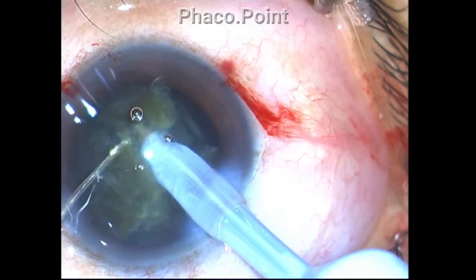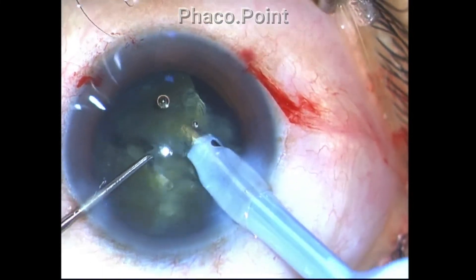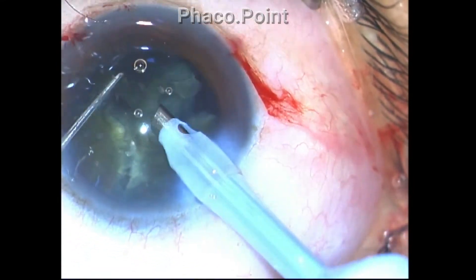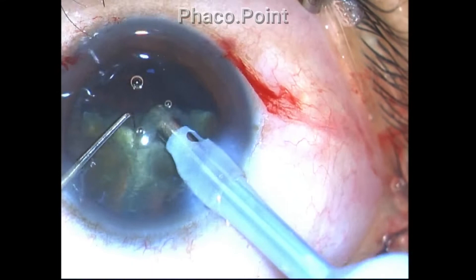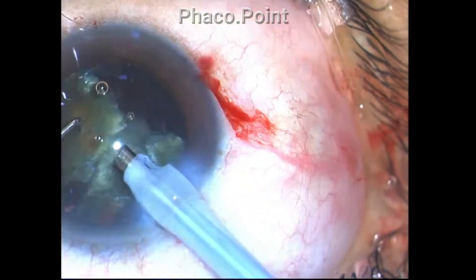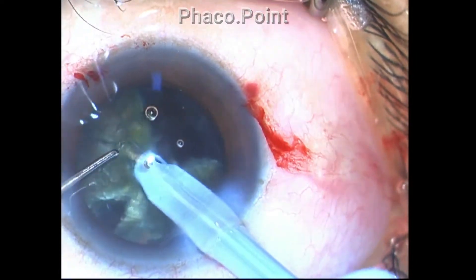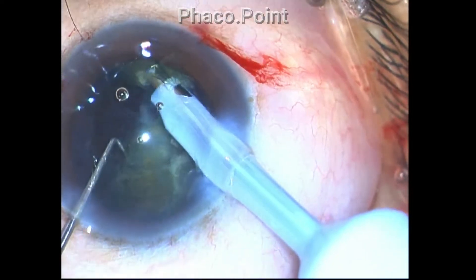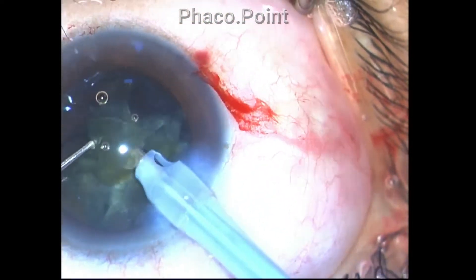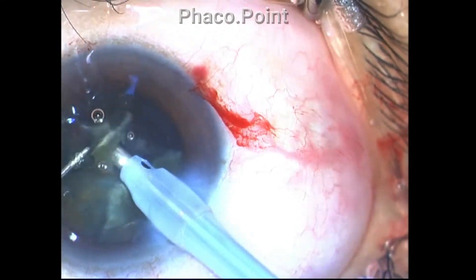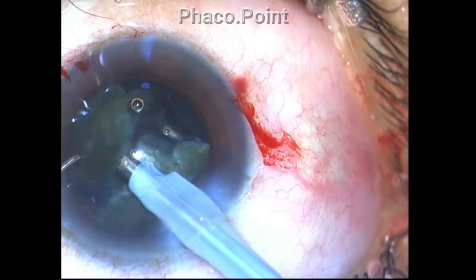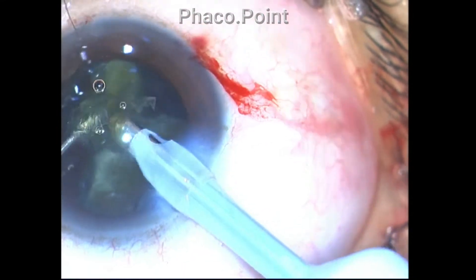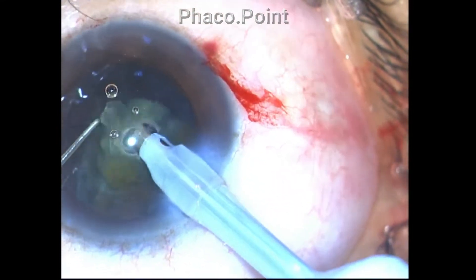Create another small piece. Even though this modification will probably enlarge your phaco time, you will definitely be rewarded with crystal clear corneas on the first post-operative day. Stay in the center, emulsify at the level of the iris plane, create small fragments, and let the rest of the nucleus remain within the capsular bag. This is why I suggest keeping the capsulorrhexis size at only around 5.25 millimeters — because a large capsule rhexis will cause the aspiration flow rate to dispel multiple nucleus fragments into the anterior chamber.